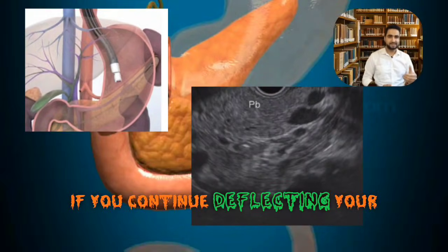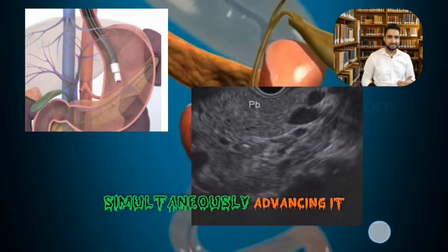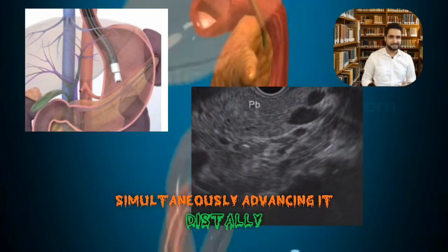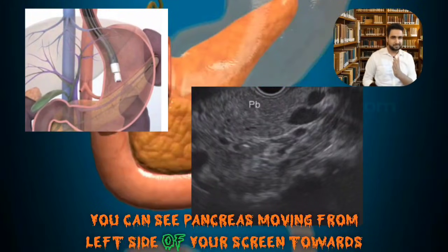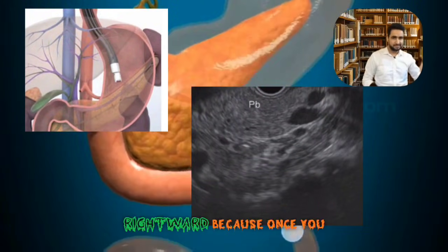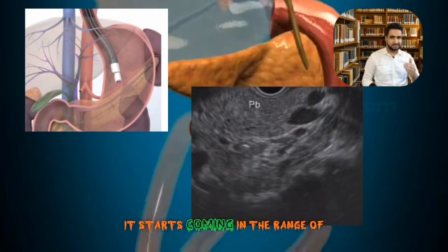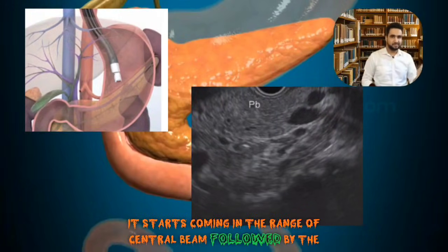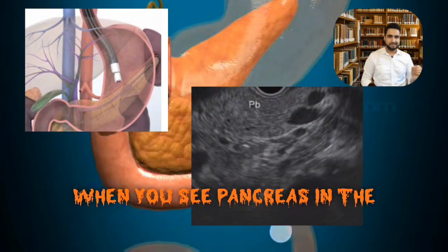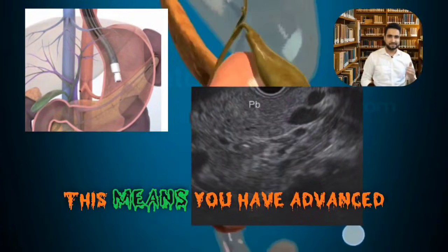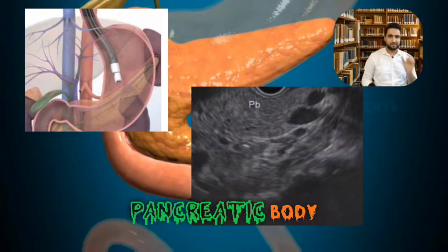If you continue deflecting the probe away from you and simultaneously advancing it distally, you can see the pancreas moving from the left side of your screen toward the right, because it starts coming in the range of the central beam followed by the shaft beam. When you see the pancreas in the center of your screen, this means you have advanced your scope to the level of the pancreatic body.